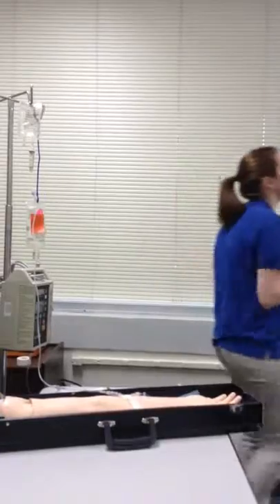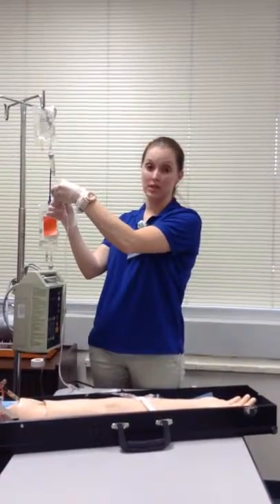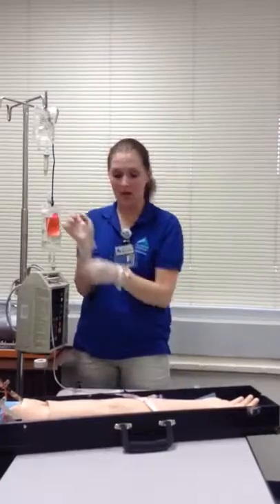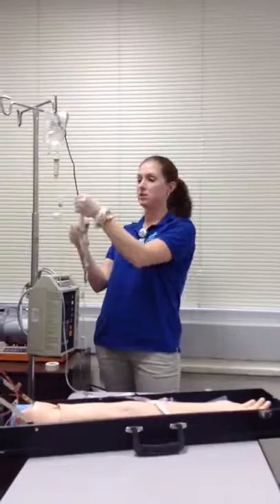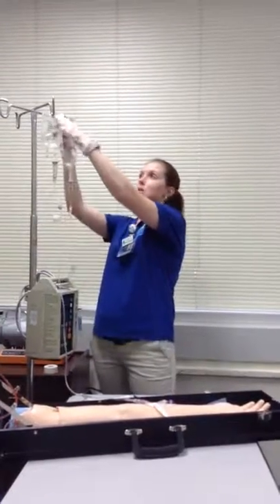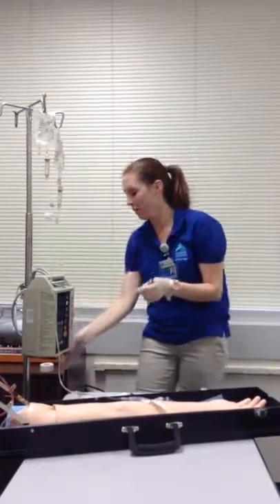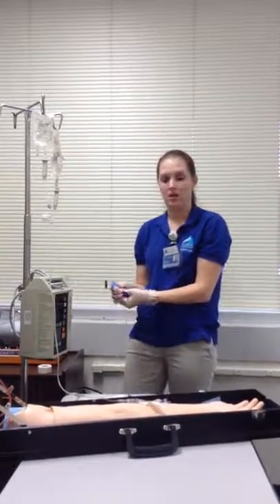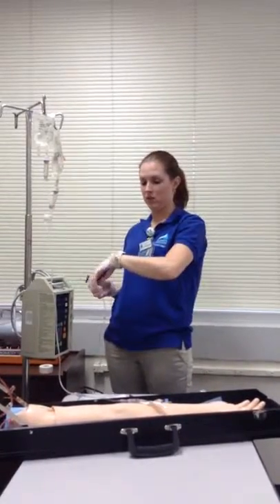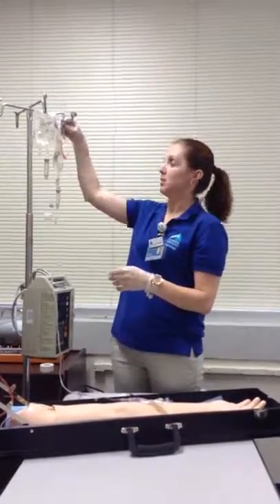Okay, so I'm going to leave and I'm going to come back. Okay, it looks like the medication is done. So now we're going to go ahead and disconnect this. So we're going to turn this off. I've got to reestablish this, so I will then put this back up here, because you've got to reestablish a positive flow. Go ahead and unclamp, and go back to my drop factor of 16 drops a minute. Okay, that's going. This can just stay up here.